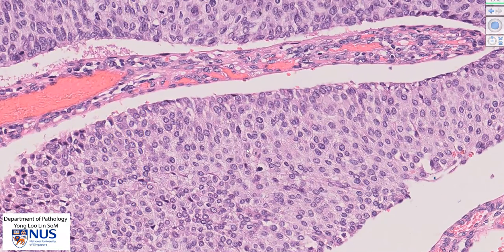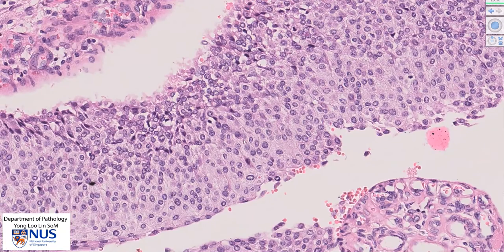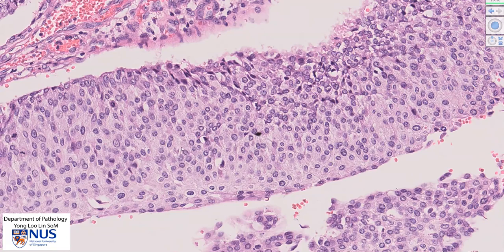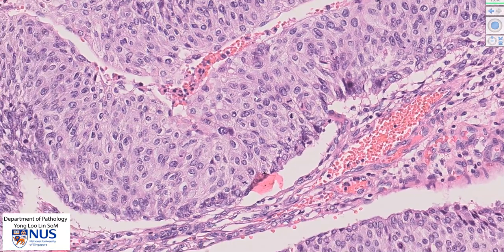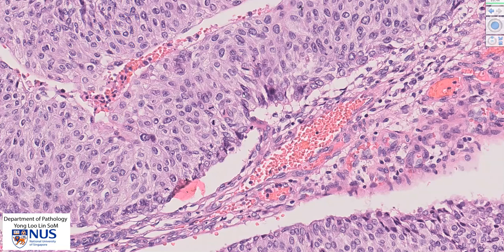There is also nuclear atypia. Some of the nuclei show irregular nuclear membranes, and there is variation in nuclear size, with some nuclei being much larger than others. For example, over here we can see that there is a larger nucleus right next to a smaller nucleus. Another feature seen in this area is quite a lot of mitotic figures — there is one here, another one here, and another one here.